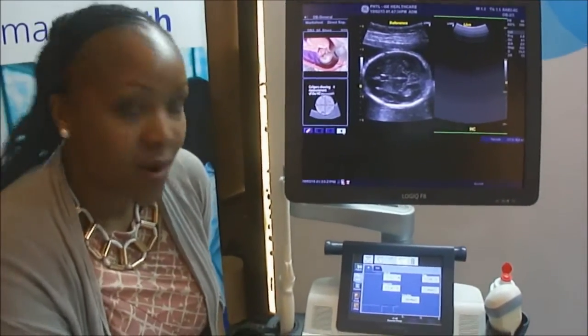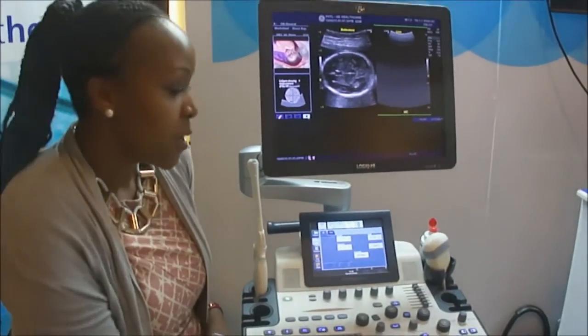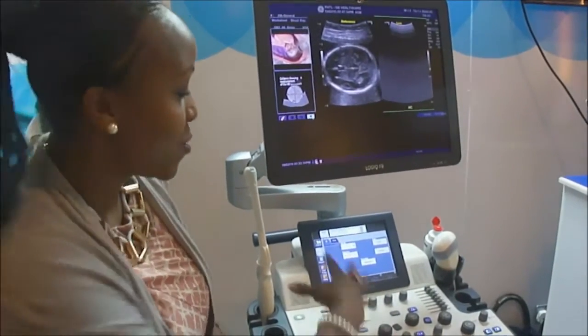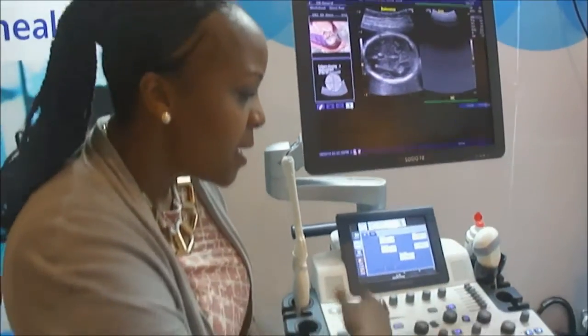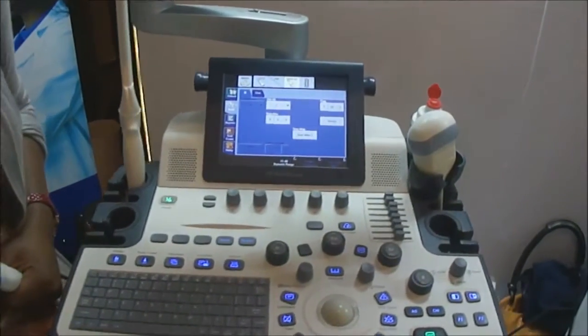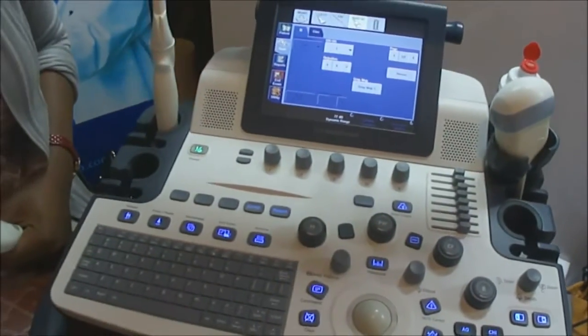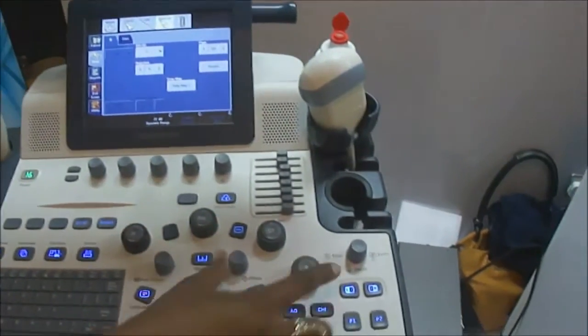It's a very easy machine to learn and very intuitive workflow. You could come in and just look around and really be able to do a scan, even though you've never used this system before. You have a touch screen panel — as you know, everybody is now using tablets — a very wide screen, very easy workflow to go through. You have your color flow, you have Doppler, and measurements are right there for you.